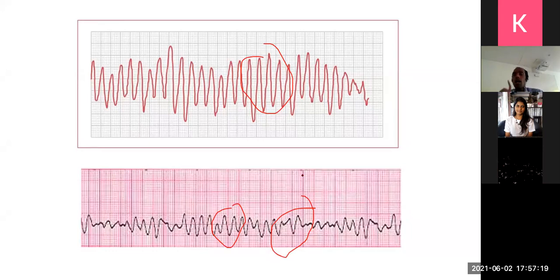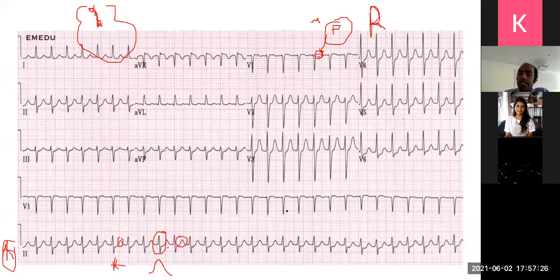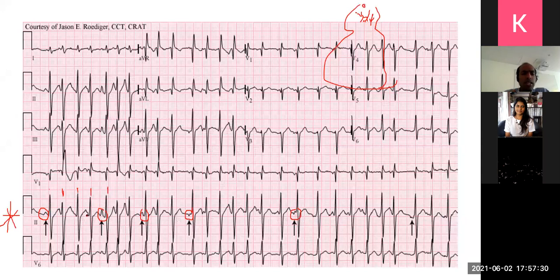Right. There is a question: in multifocal atrial tachycardia, P wave is not absent, right? You will get some sort of P wave. ඒ P wave එකක් තියෙනවා. maybe හැම එකේම මේ මොකක් හරි P wave එකක් තියෙනවා. හැබැයි ඒක abnormal, tall, short, inverted, whatever එක එක විදියට.